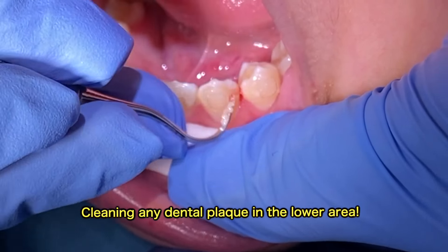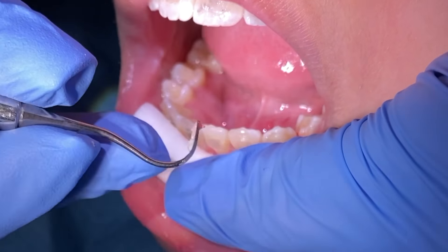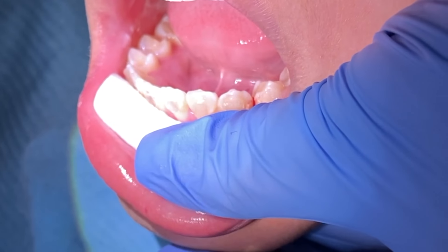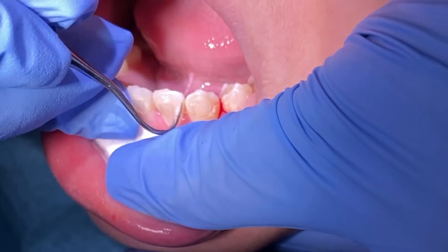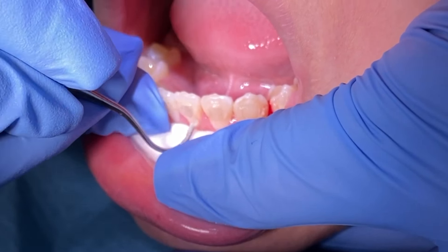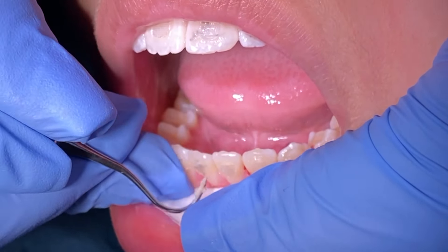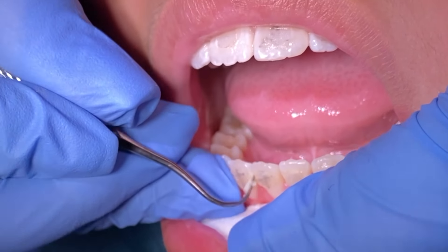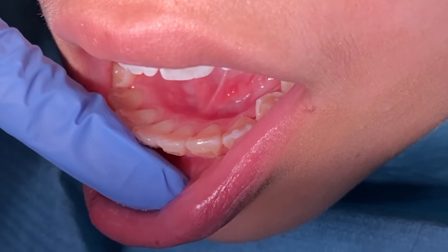The steps that we take here to bond a lower three-to-three retainer: first, you want to make sure that any plaque that is present is removed, because you don't want it to interfere with the bonding of the three-to-three. You will then make sure that you apply some etching material.